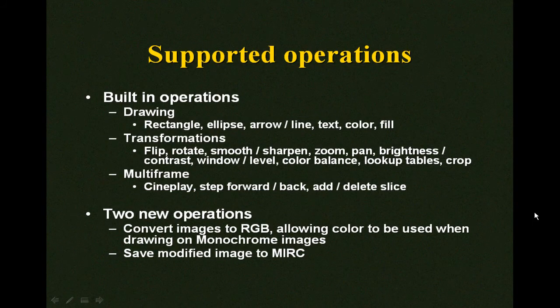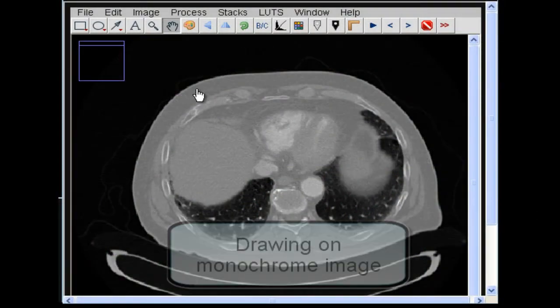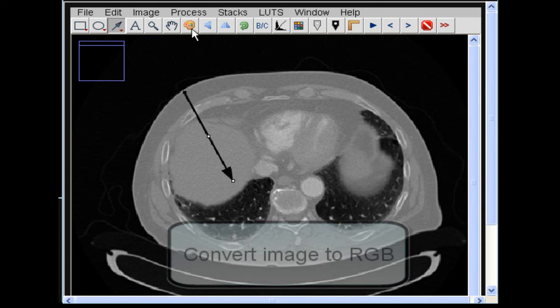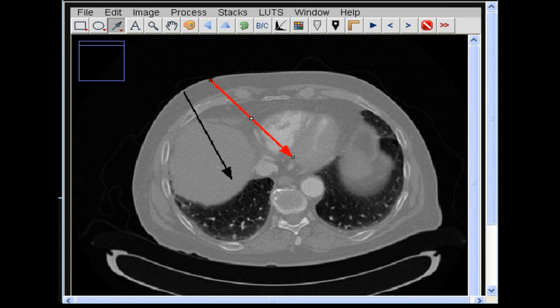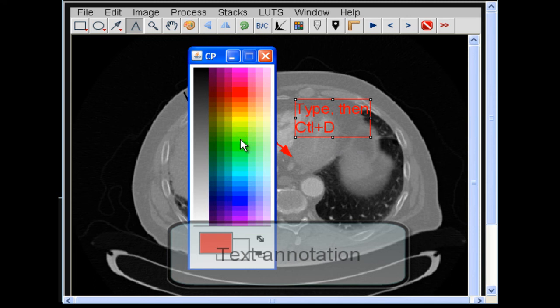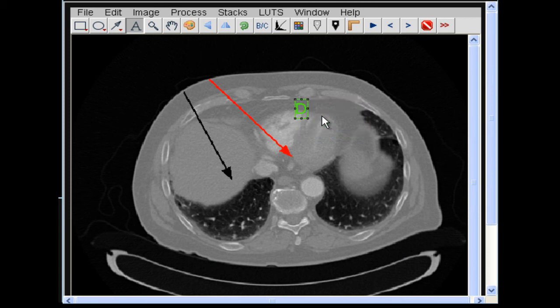ImageJ has quite a few built-in operations. It has support for drawing on images, transforming the appearance of images, and several features that allow the user to manipulate multi-frame images. The user selects the arrow tool and draws on the image. Since this is a monochrome image, all additions made to it will be in grayscale as well. The user clicks on the color palette button, converting the image to RGB, and can now draw on the image using color. Text can also be added to the image using the text tool.